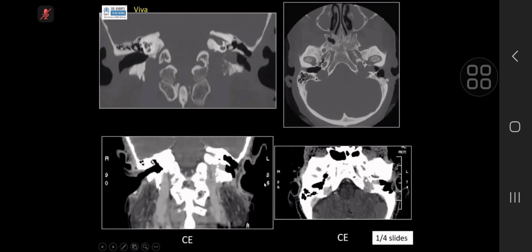So everything is correct, whatever you said about this particular location. Yeah, but I am not satisfied with the location. Everything you told me is absolutely correct. But you used the word glomus jugulare. What part of anatomy is this? Oh, sorry, tympanicum. Okay, tympanicum.